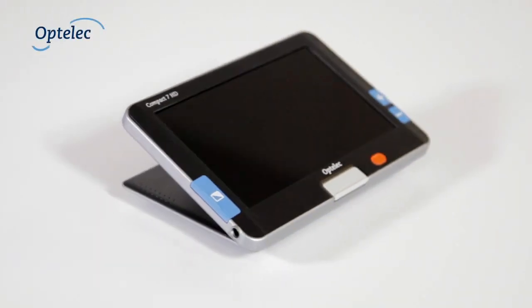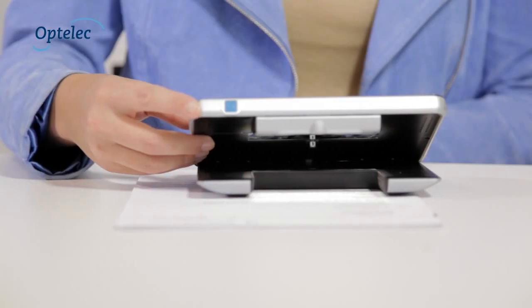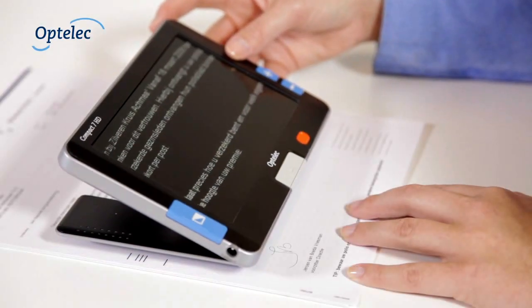Do you have trouble reading? The Optilic Compact 7 HD is the ideal solution if you're visually impaired but you would like to read in a comfortable way. This video demonstrates how the Compact 7 HD can be used.